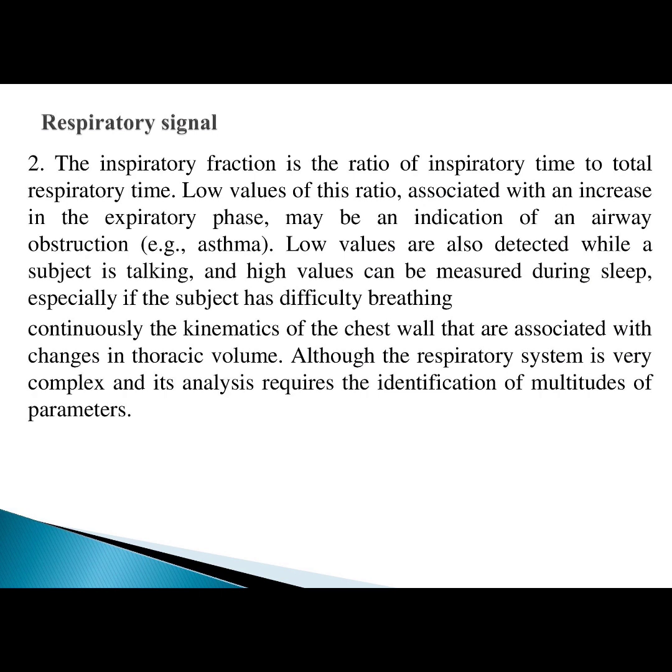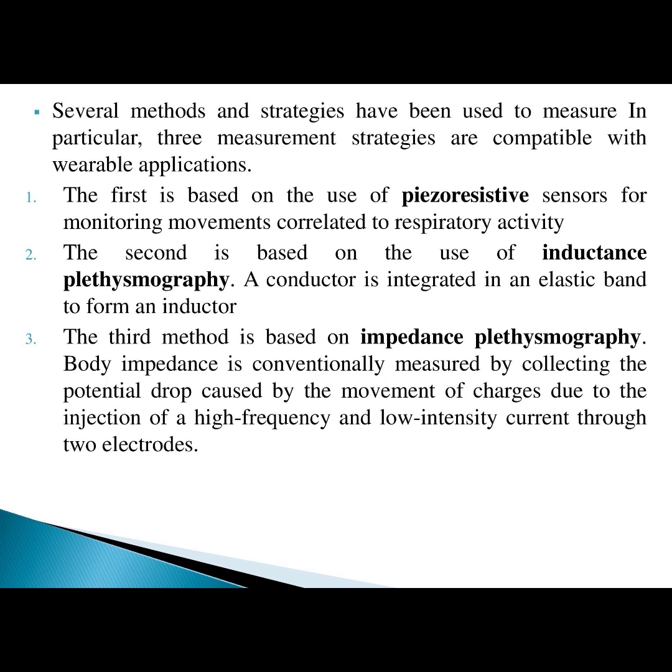Although the respiratory system is very complex and its analysis requires the identification of multitudes of parameters, several methods and strategies have been used to measure it. In particular, three measurement strategies are compatible with wearable applications. The first is based on the use of piezoresistive sensors for monitoring movements correlated to respiratory activity.